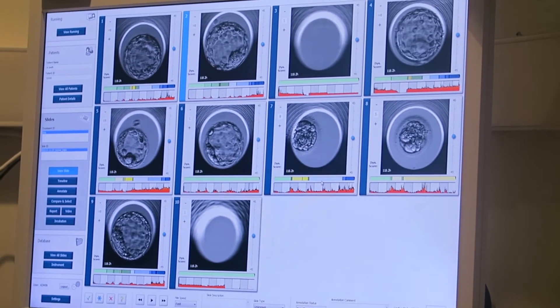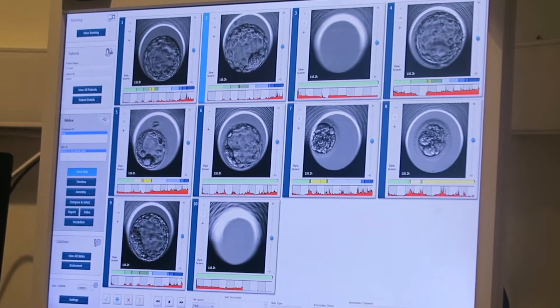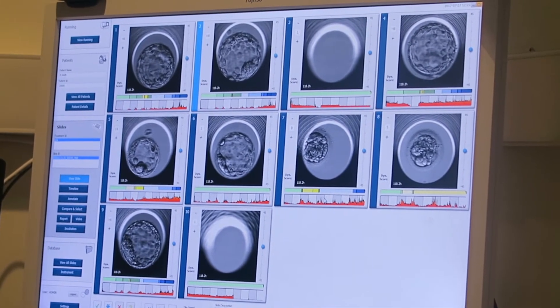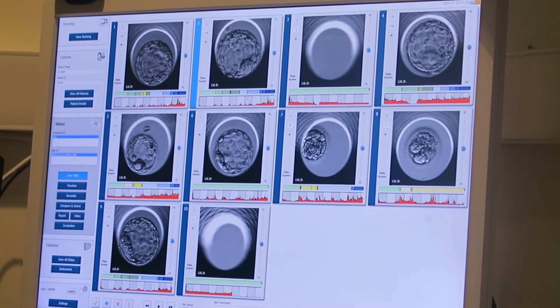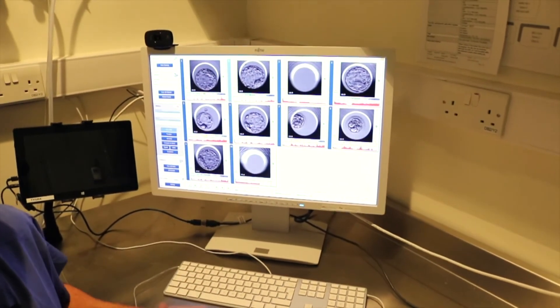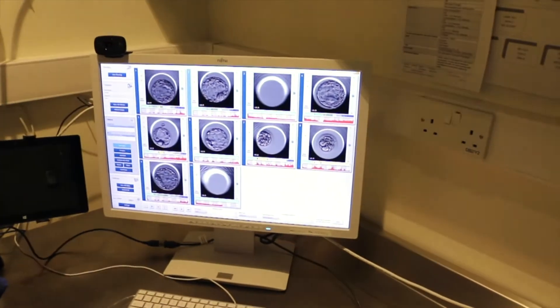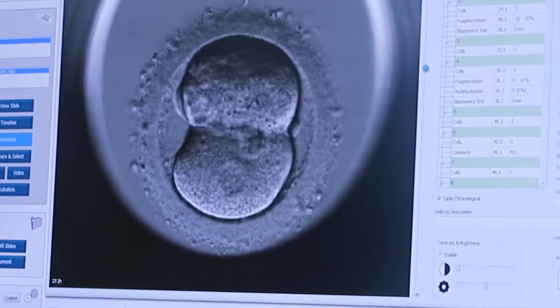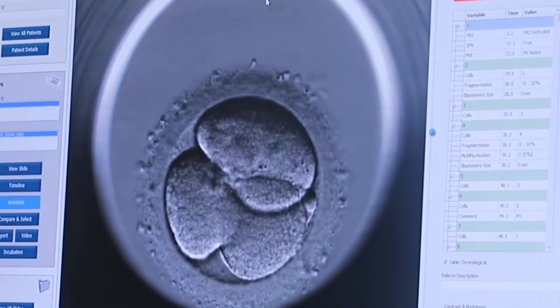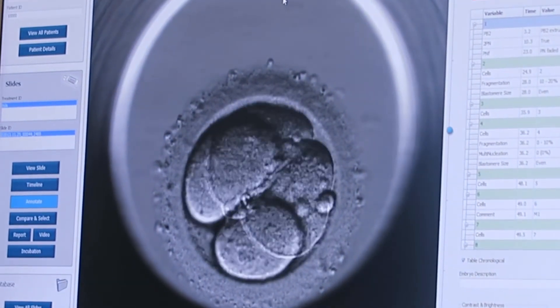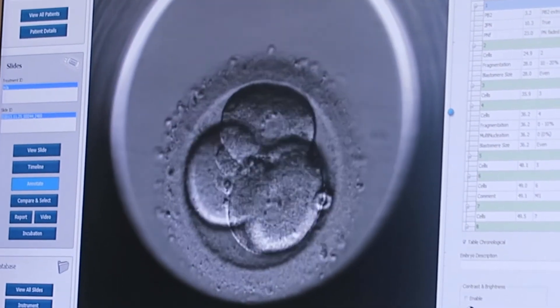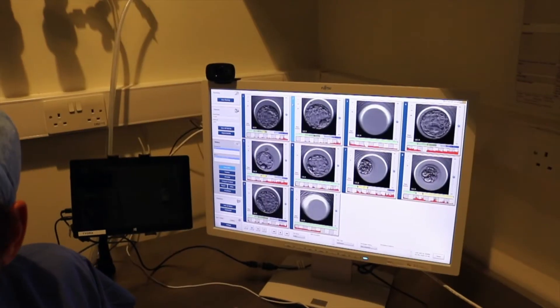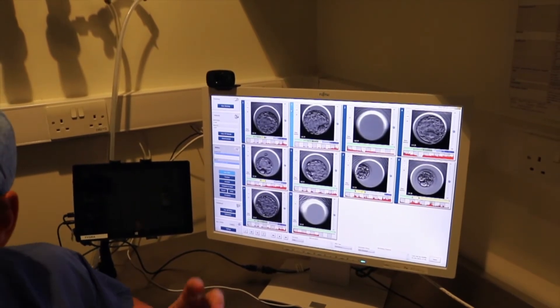So George will ask me, which one are you going to pick to put back into my patient? Using this time-lapse technology we're able to apply lots of different tests to these embryos. We're able to see which one was developing in line with all the babies that have been through this time-lapse system that have been born and been healthy. We run this algorithm test and it tells us the way the embryo divided — which one is in line with the perfect model of the one that's going to make a baby. Using this test, we have identified that embryo number two here has the highest chance of forming a pregnancy. It has developed perfectly in line with what we would expect from a blastocyst that is going to go on and make a baby.